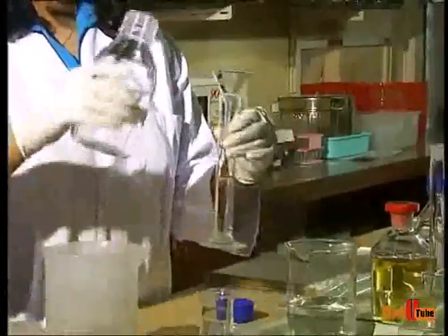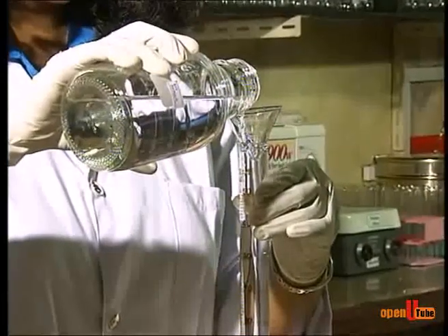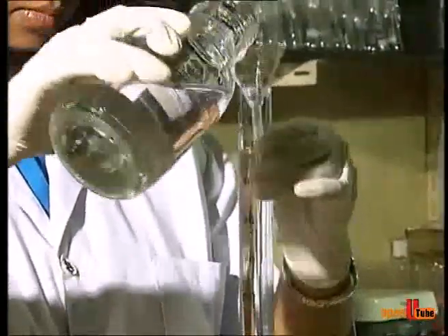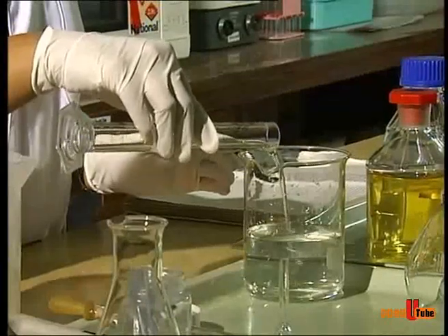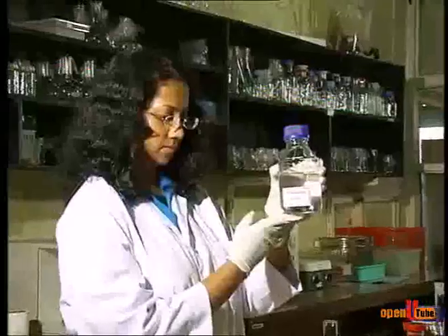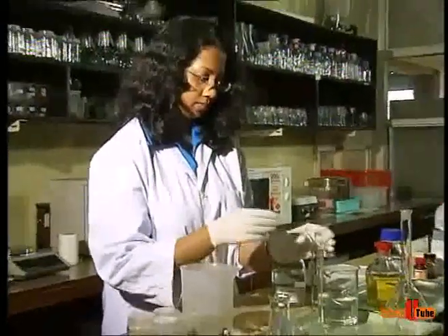Similarly, add macro 2 and macro 3 solutions into the same beaker. Then transfer the required volume of micronutrient or minor solution into the same beaker.